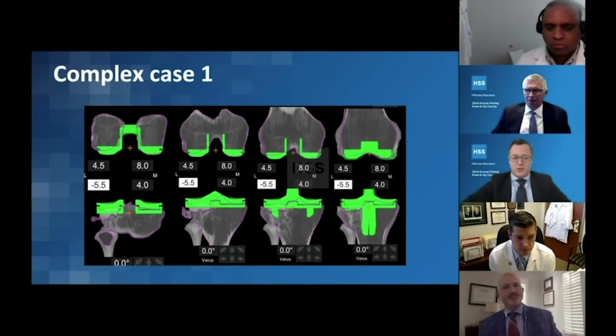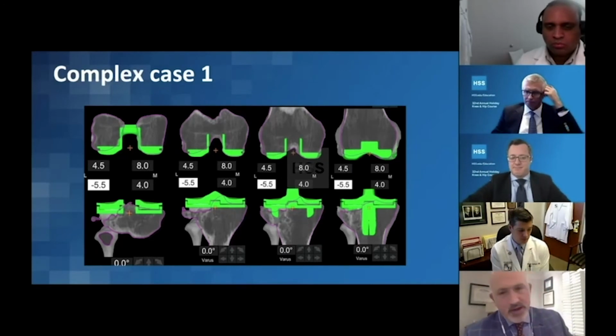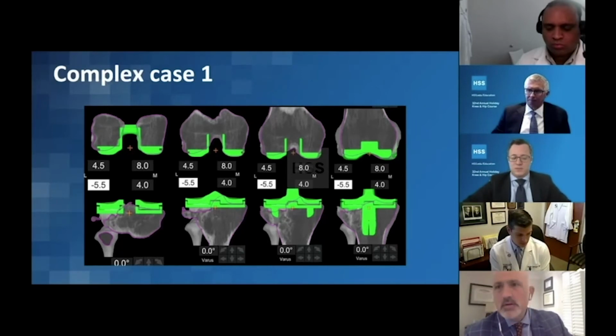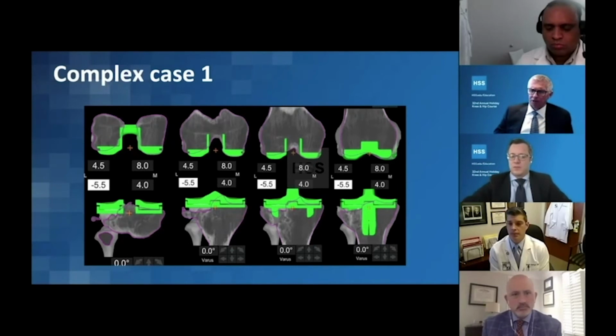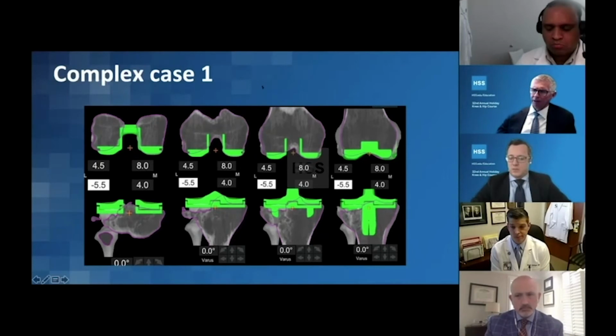Bolo, any role here for a cone, sleeves, anything like that? Well, I think it's going to be okay, like Springer said, with a sort of screw and cement. That's probably what I'm leaning to. I think it's great to have it in the room and available, but I think you're okay with stopping short of it. If there was any doubt in terms of bone quality, what Brian mentioned in terms of putting a little stubby on there, I think it never hurts to do that. She's thin, but any hint of being a little bit heavier, I would absolutely go with a little stubby stem and cement it the whole way down. It's insurance.